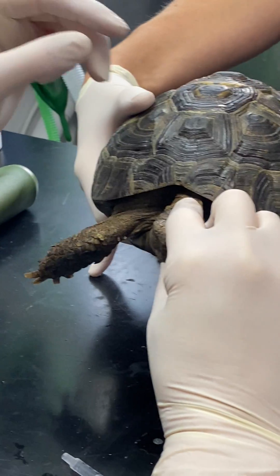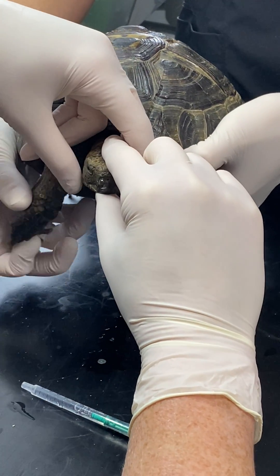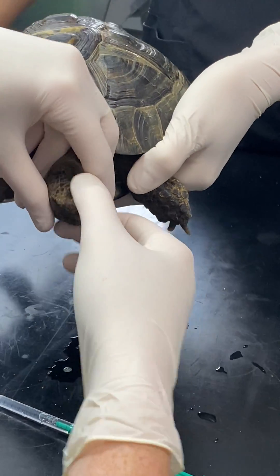We just gently restrain our tortoise — she's very well behaved, but she also feels pretty rubbish, bless her, so she's being very cooperative. You can see the nasal discharge coming out of her nose. We gently want to elevate her bottom so the head is down.